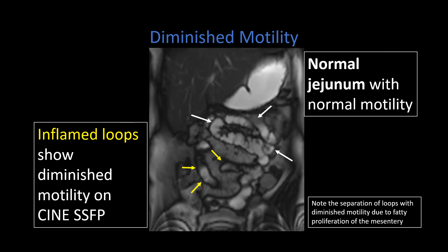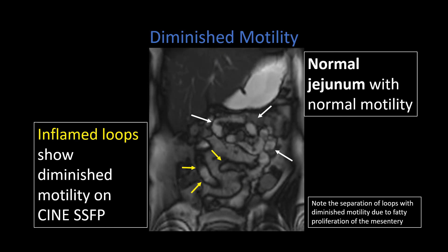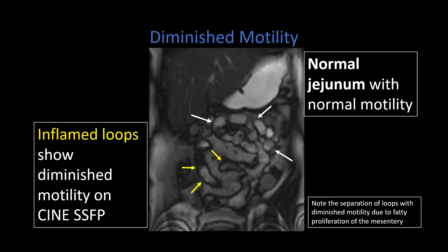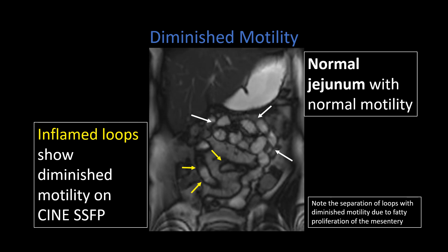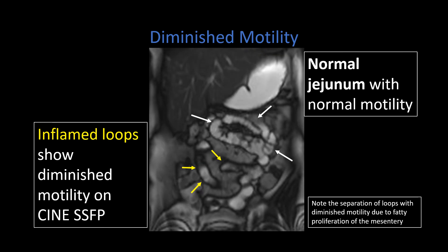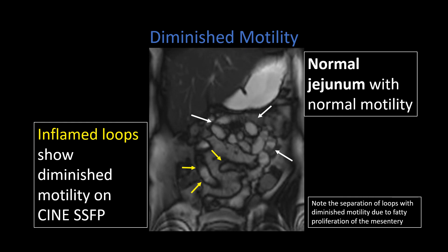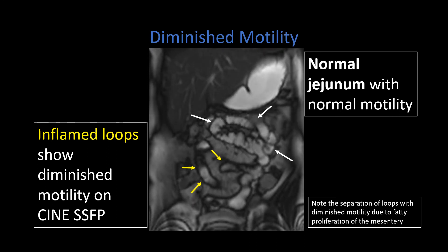Another tool in our toolbox when using MR enterography is cine imaging. We can do steady-state free precession cine imaging of the bowel to look for areas of diminished motility. On CTE or MRE, you may see an area of collapsed bowel that looks like luminal narrowing, but it could be a peristalsing segment captured at one moment in time. The cine imaging captures peristaltic activity over time and helps identify abnormal areas. In this example, white arrows point to multiple loops of jejunum showing normal peristaltic activity, compared to yellow arrows pointing to the distal ileum in regions of active inflammation. Also note the mesenteric proliferation or fatty proliferation of the mesentery separating those loops of inflamed bowel.